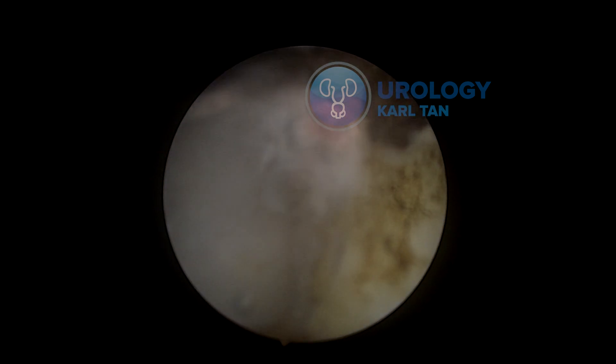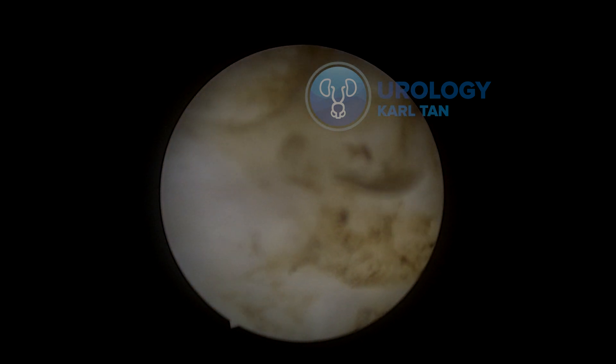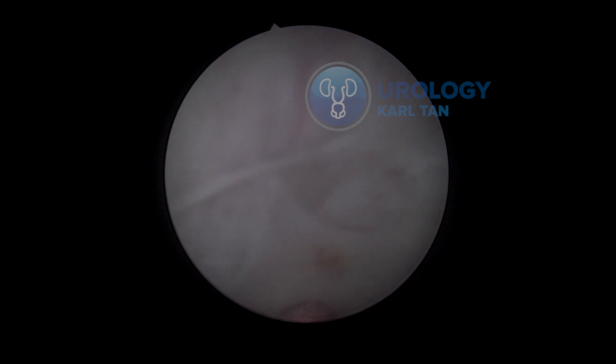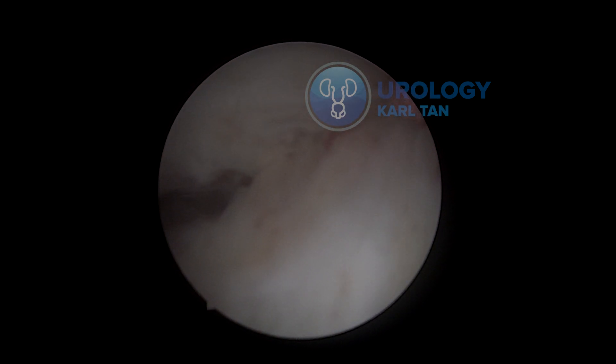As you can notice, there will be charring, but it is less than expected for a thulium continuous wave thulium YAG. I do another blunt dissection sweep, then release it using the laser. This is quite like a routine — I make the technique as standard as I can, repeating all steps regularly without missing any.